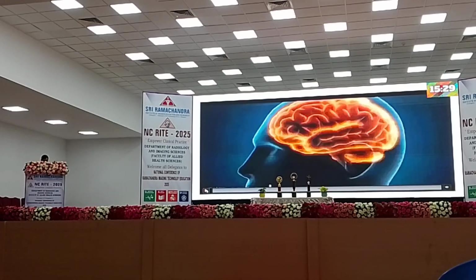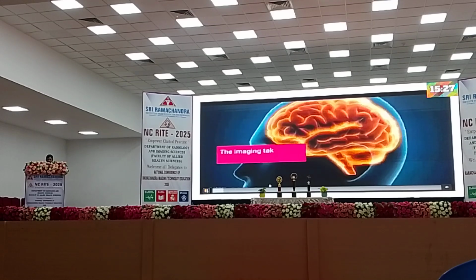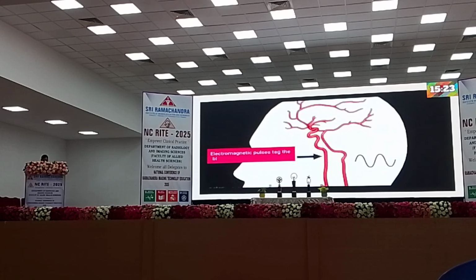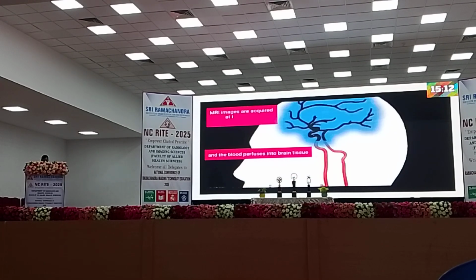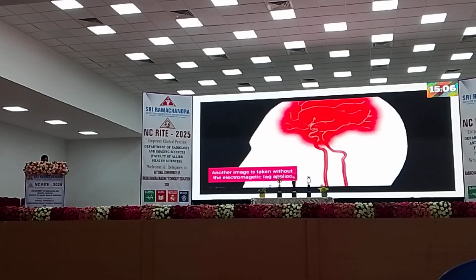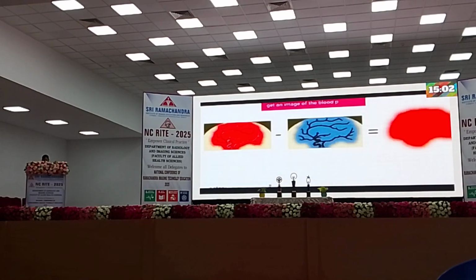So this is a small video of how it works in our brain. We are going to apply a 180-degree RF pulse here. That is inverted, which is going inside and perfused, and we take that image, which is called the tag image. Again, without the 180-degree RF pulse, we acquire the image, that is the control image. So control image minus tag image will give the perfusion image.